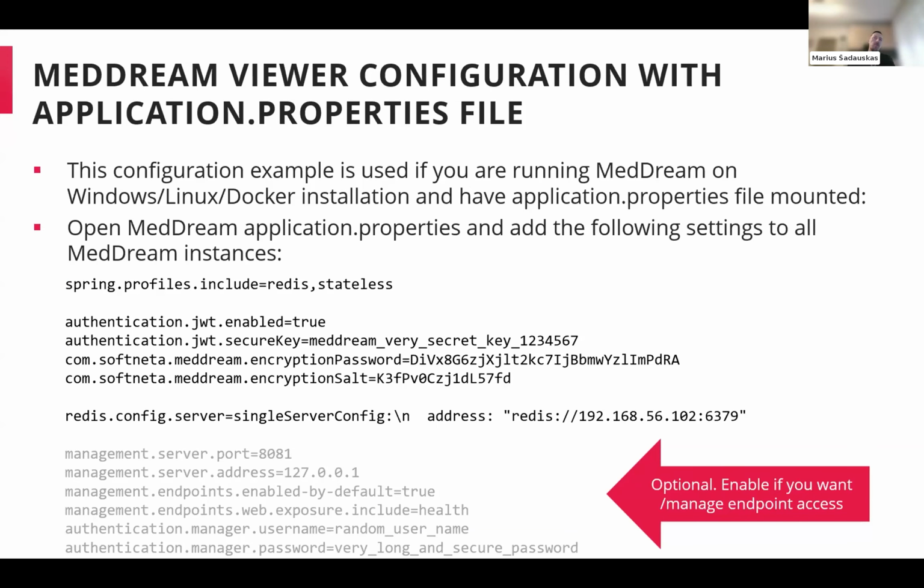Now let's jump to the more technical thing: the configuration of the MedDream Viewer. I will provide a few examples of how to configure MedDream Viewer with Redis or Valkey.